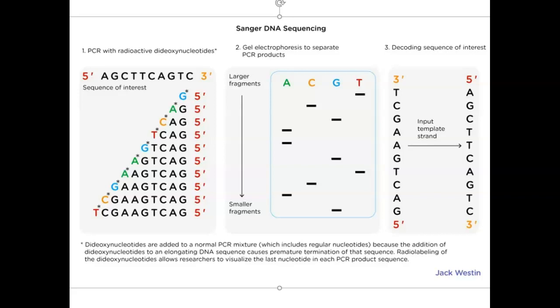We use this a lot for identification of organisms, and a lot of things in medicine, especially microbiology and healthcare, are moving towards this. Many people think that the days of MLTs just plating organisms from a patient sample on different types of selective and differential media, and doing all kinds of TSI or MSA plates or chocolate agar, those days are quickly ending, because all of those tests exist to identify a particular organism.